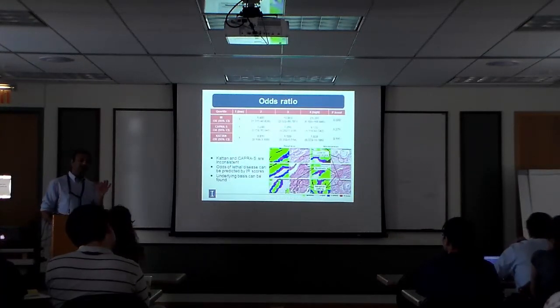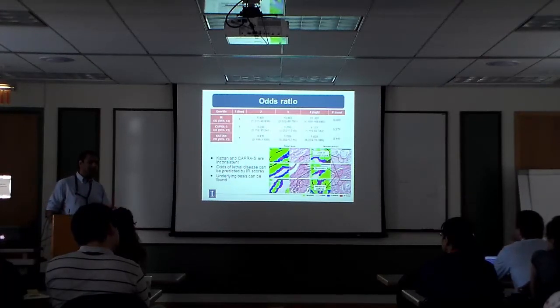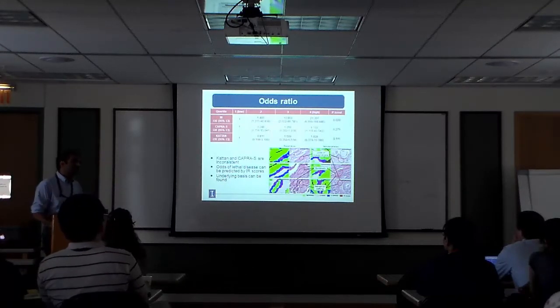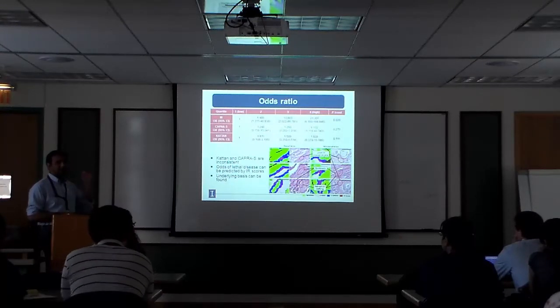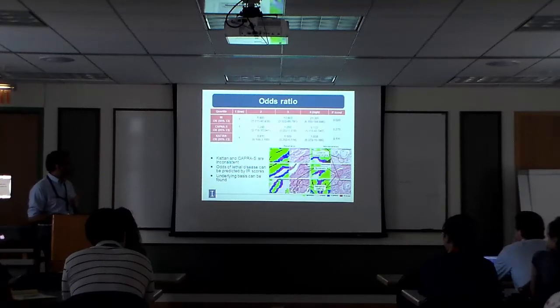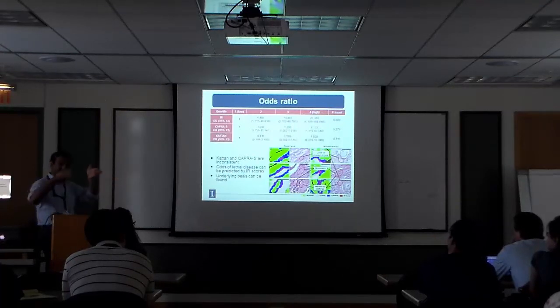We can go back to the microenvironment of the tumor and figure out quite precisely where this information is coming from. We can then make better predictions based on what this tells us. We can perhaps go in and do genome sequencing here and say what really is changing. This is still an ongoing story, but at this point, what we've been able to do is bring up a risk score, right? Remember, these are the 70% of patients right in the middle where we can't do a good job.